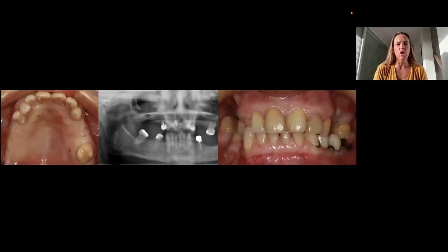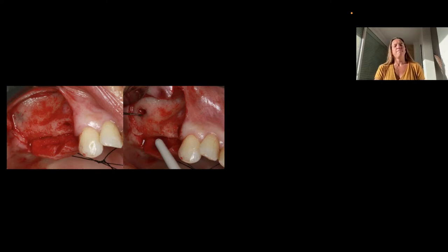So we go through a clinical case in order for me to show you exactly what I mean. This patient, tooth number 14, was hopeless, and she wanted to have fixed teeth where she lacked the teeth. And so basically what we did is that we planned for her two half All-on-4 in the upper jaw. So how do we do this?